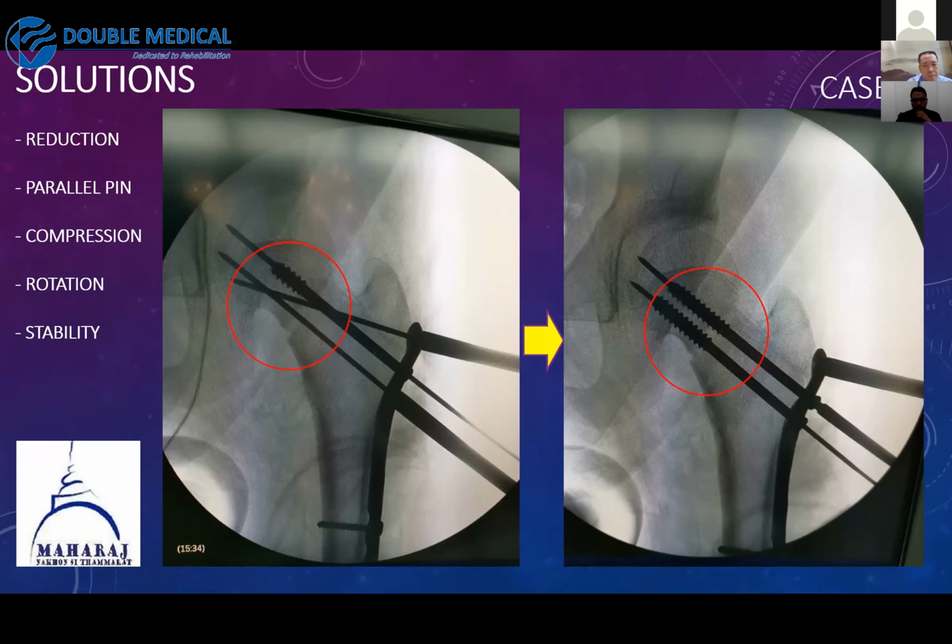With PFP, first the fracture is reduced, and PFP was applied and fixed with the compression screw. I temporarily fixed it with three wires, 2 for parallel lines and 1 for an oblique line, to increase rotational stability. In the picture on the right, I compress this fracture gap with a standard cannulated screw first in the parallel line. You can see the fracture gap is closed in the second picture, and before you compress the screw, you remove the oblique wire.